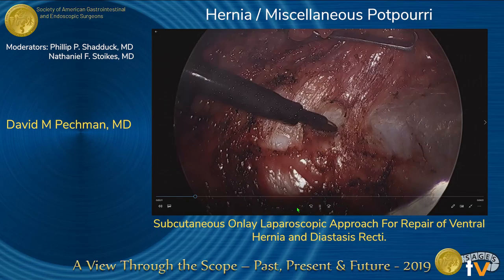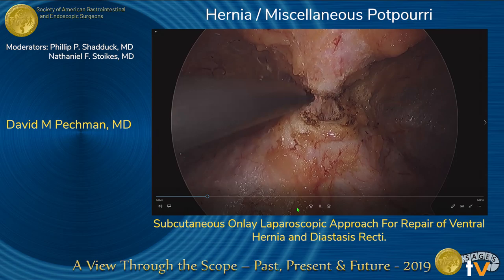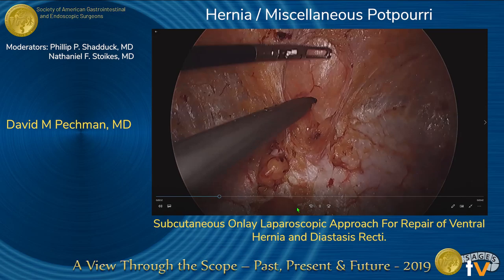The dissection was continued laterally to each anterior superior iliac spine and superiorly beyond the costal margin. An umbilical hernia and a superumbilical ventral hernia were identified. The fat-containing hernias were dissected from the anterior subcutaneous tissue and reduced.